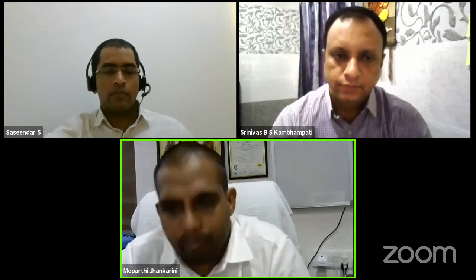Okay, so how do you retain the cylinder inside the tunnel? You just punch it a little bit inside, up to 2 to 3 mm. If you take the cylinder slightly bigger than the tunnel, it is a press fit. Press fit graft. That's the thing.